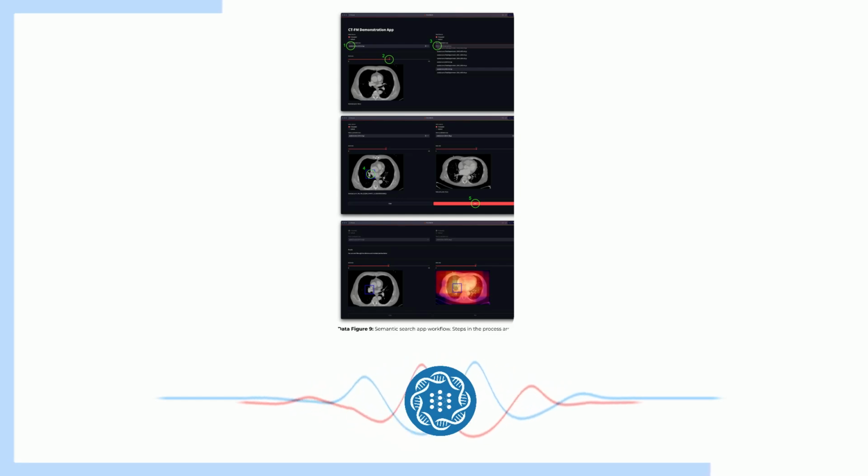Yeah. So they used this to further explore CTFM's anatomical understanding. For example, if a doctor selects the heart on one scan, CTFM can find the corresponding heart region in other scans, even if those scans are of different patients or were taken from different angles. Exactly. And it did this with remarkable accuracy, consistently identifying the correct anatomical regions across a variety of different scans.